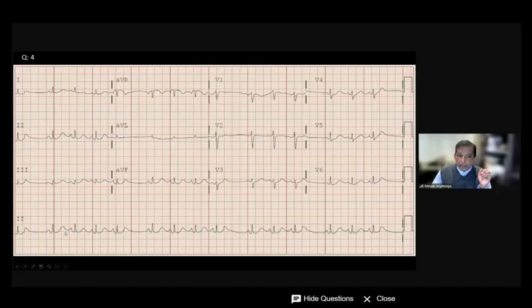And you see P wave, QRS, P QRS, P QRS, P QRS, and there's nothing here. And when you see a gap, the first thing that you should notice is this. When there's a gap, first, what is the commonest thing for a gap when you have a telemetry patient? Most common thing, when you have a gap like this, is a non-conducted PAC. That is a pearl I want you to know.